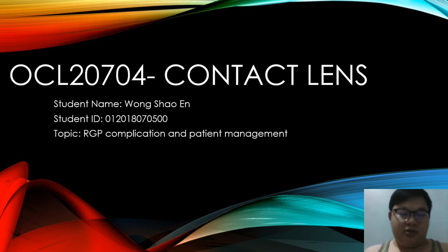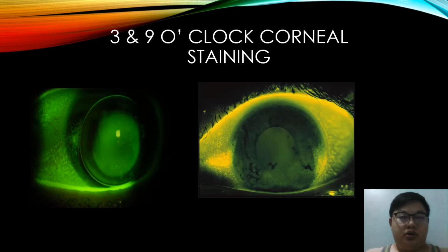This is the presentation for the contact lenses. My topic is the RGP complications and patient management. This is the usual complication that happens in RGP lenses.